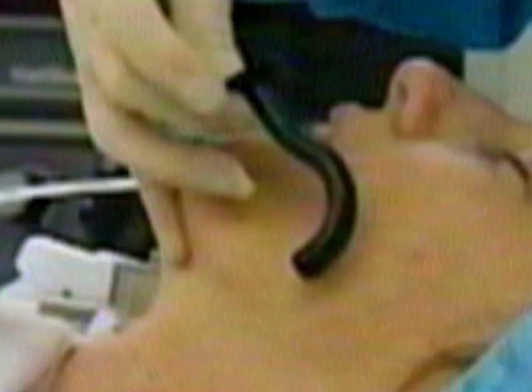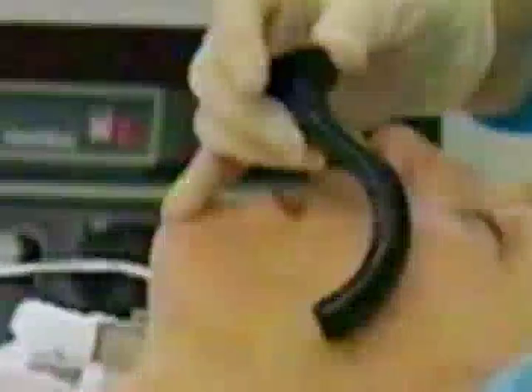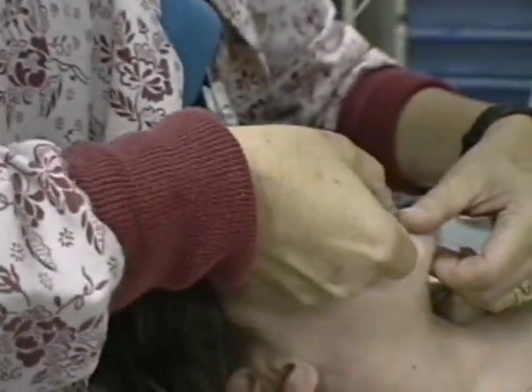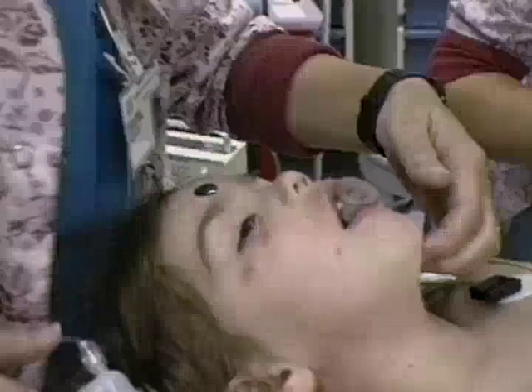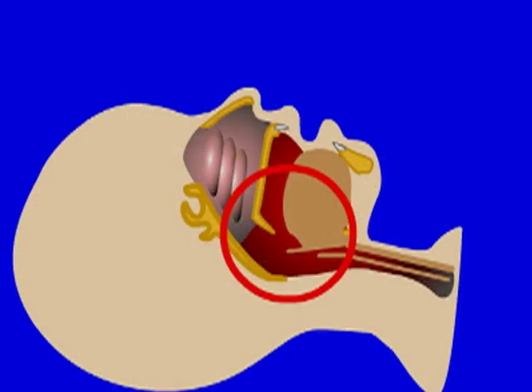To estimate the correct size, place the oral airway next to the patient's jaw and judge where the tip will lie. Too short pushes the tongue back over the larynx, worsening airway obstruction. Too long extends outside the mouth and interferes with mask fit. While an awake patient often won't tolerate an oral airway, it's often a better choice than a nasal airway in unconscious children. The oral airway avoids the risk of bleeding caused when a nasal airway injures hypertrophied adenoids. Open the mouth as wide as you can and insert the oral airway. Slowly advance it until the tip is behind the back of the tongue.